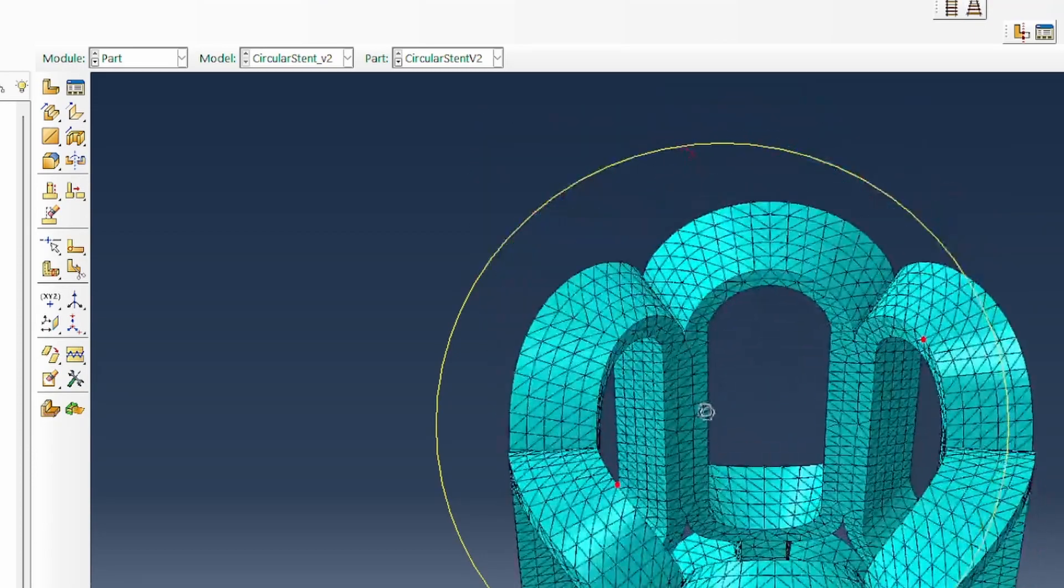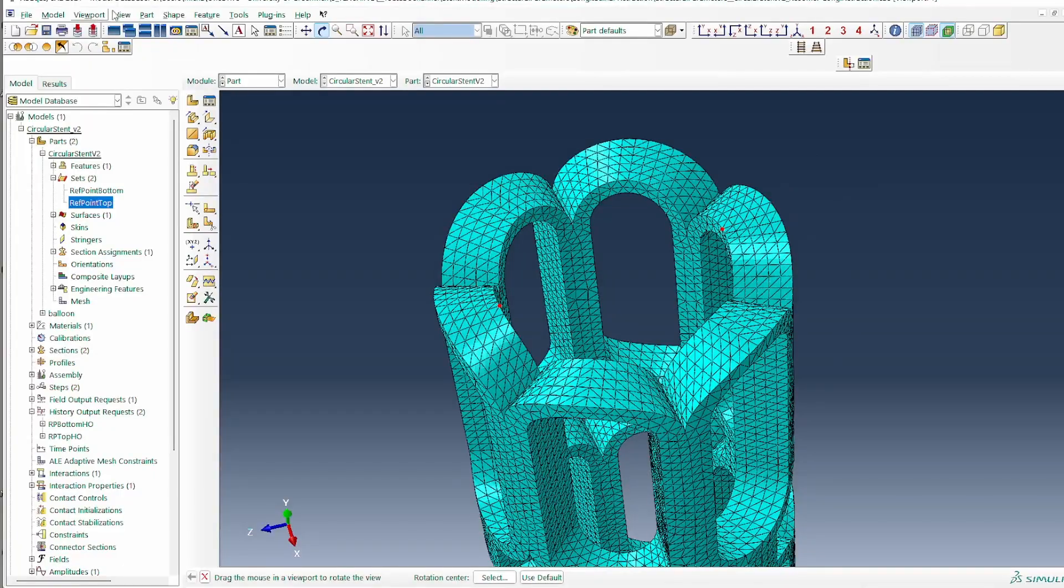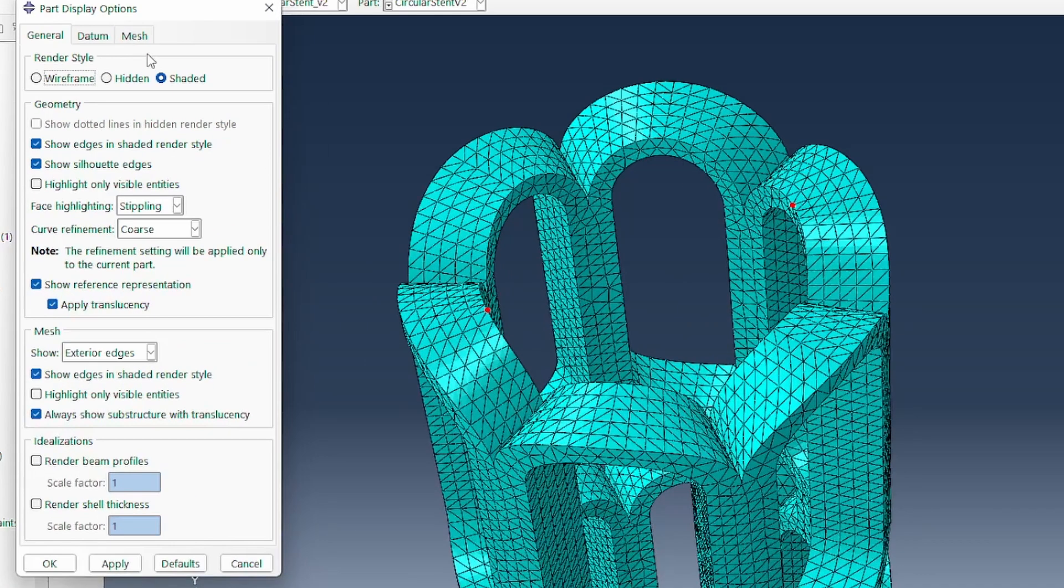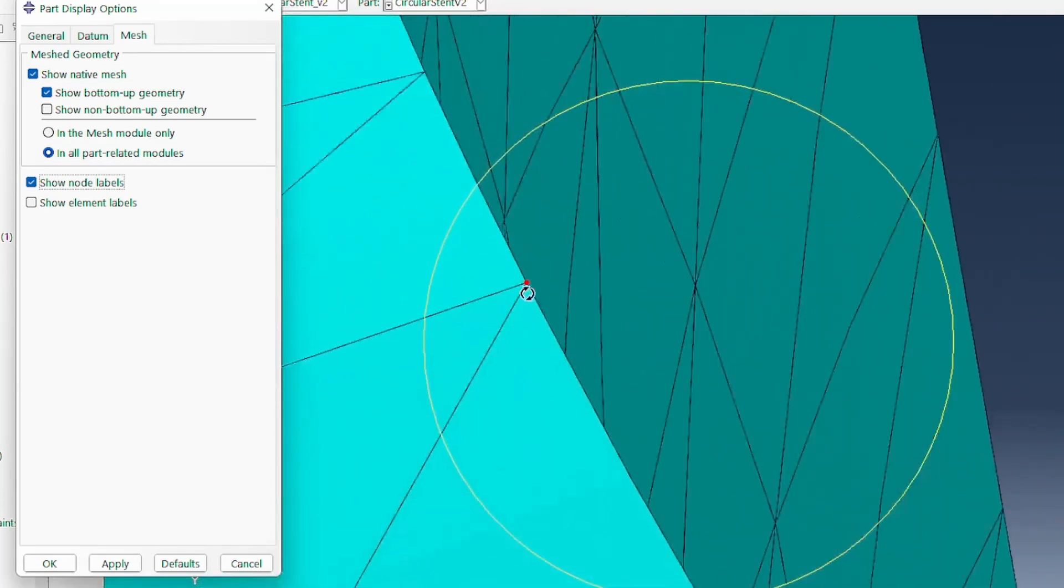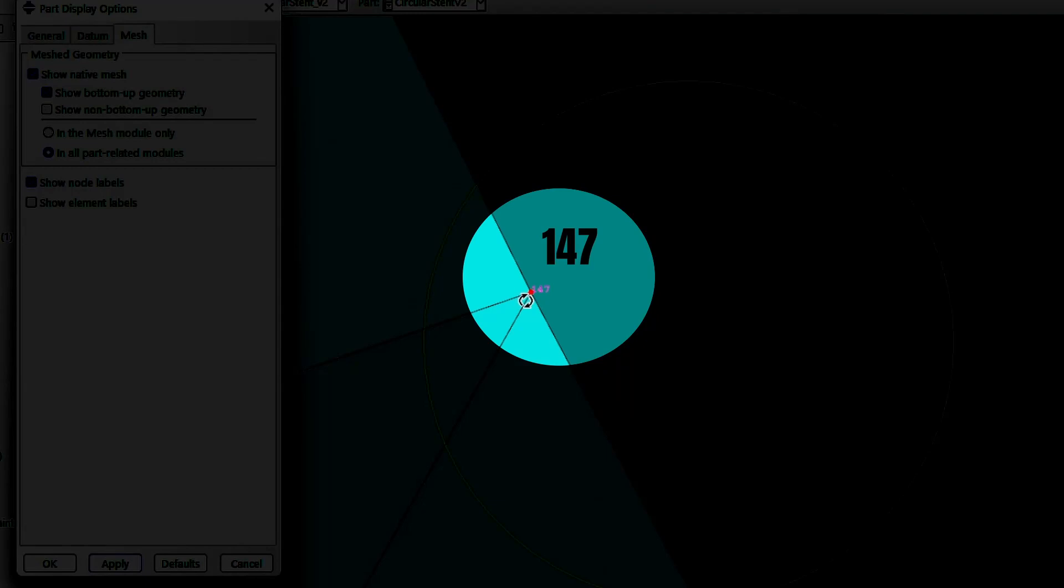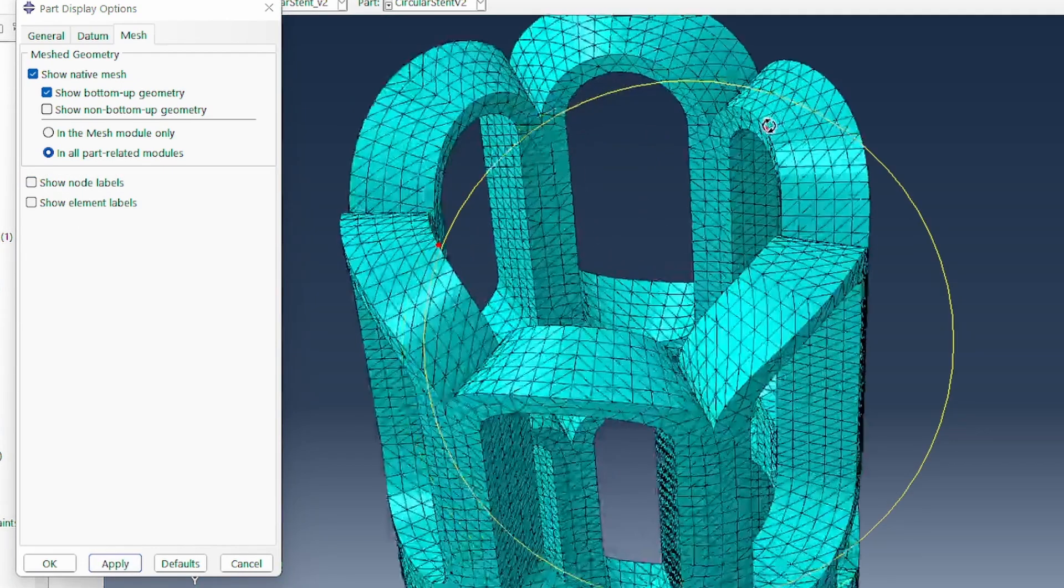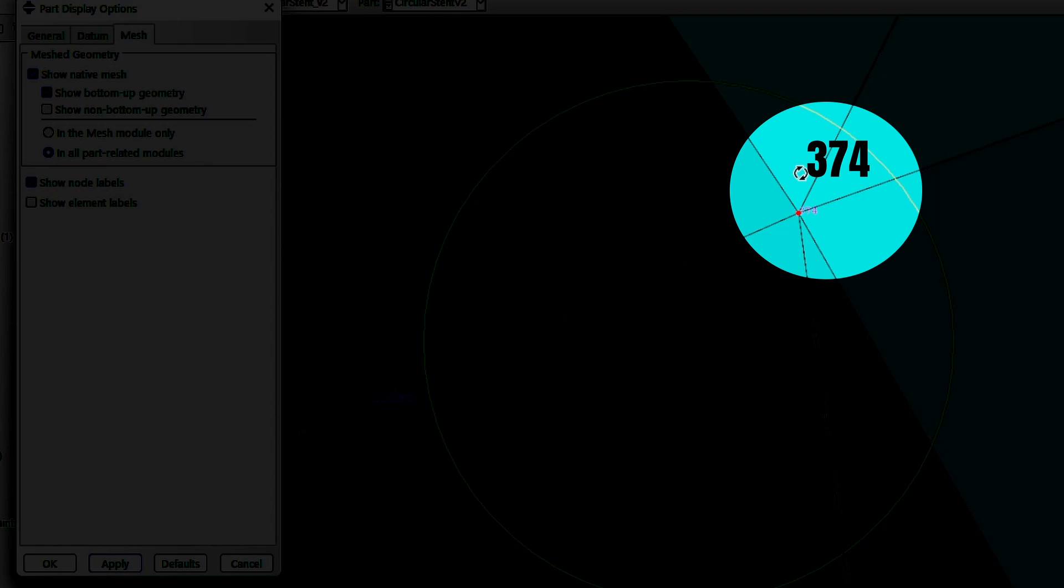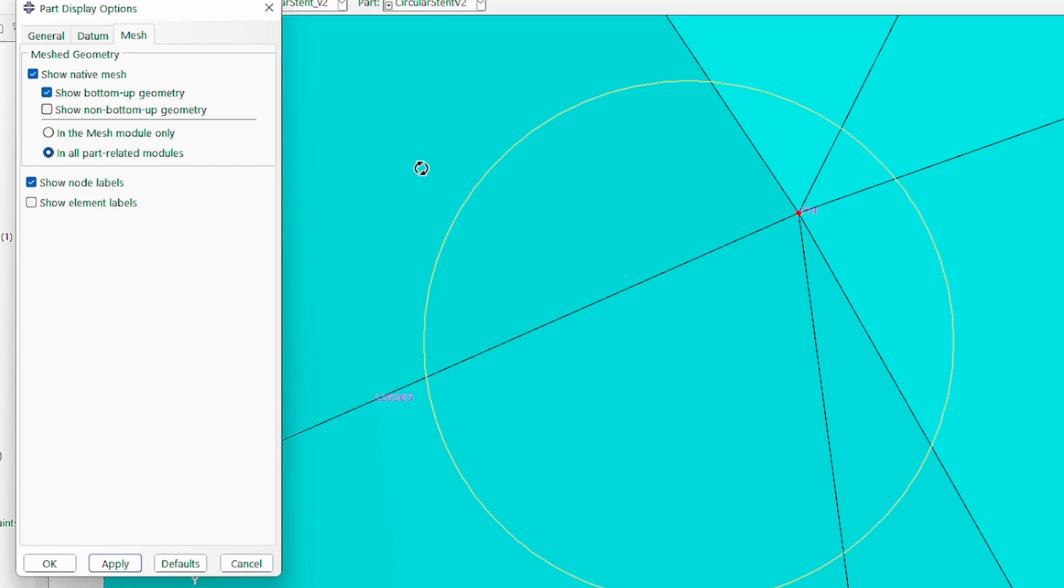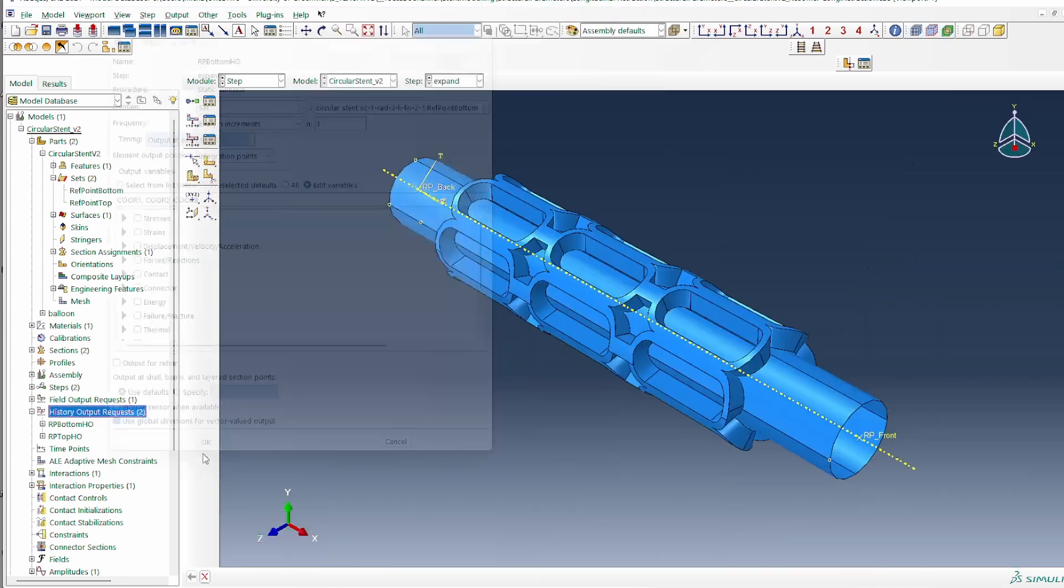So if we go back to our model right here, clearly what we want to do is find which one is the left, which one is the right, even in this case. So this is basically the ref at the top. And so I'm going to note this as my left and this one as my right in this, just like this image shows here. We'll go to view under part display option and under mesh. So I'll tick up and I say, okay, I want to show me the node level. So let's zoom in just onto this left one, this first one, and then you click apply. So it gives us 147. So you note that as 147 for the left, and then you go back and then zoom to the right and then go in to see exactly what's happening here. And then you show again. So 374. So 147 and 374 for left and right. You do the same for the down part and you note those values.